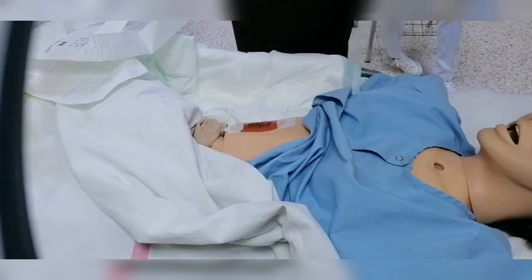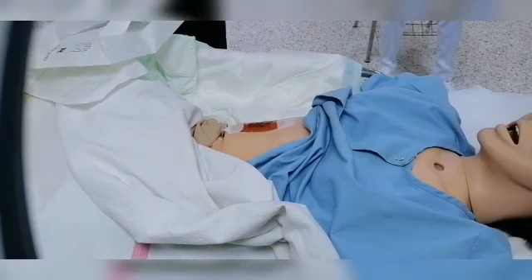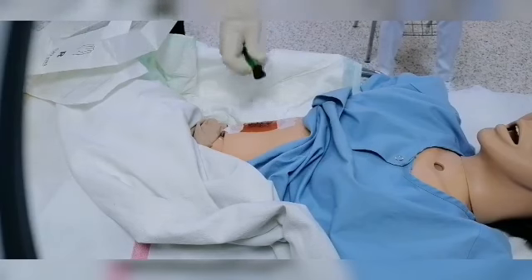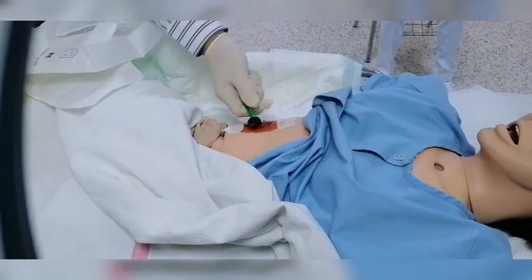I will squeeze it. I can use also the other scissor or the other tweezer for squeezing the extra fluid. Then a rolling motion. I will pass over the side of the wound only one time. So it is just a rolling motion like this.